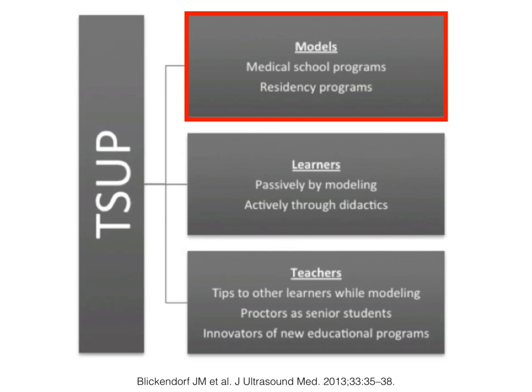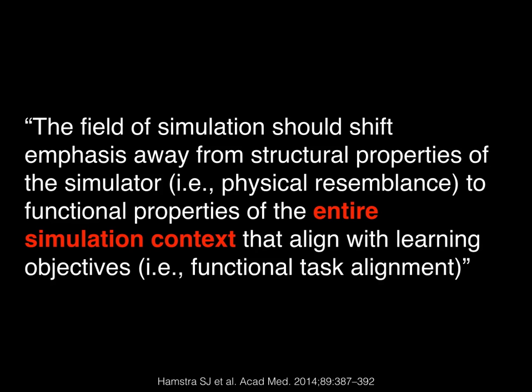But you can set up your simulation model to benefit you as you need. And you can see here the models and the learners and the teachers are all pulling things away from that. So in that education learning environment, this is a great model. And he brings it back that the field of simulation shouldn't necessarily focus on the resemblance of your simulator to people as a fidelity model, but rather the functional properties and how that simulator fits into your educational context. So you don't necessarily need the highest and most expensive simulator. You need what's going to accomplish the goals you need for that simulation task and for your context. And that depends on what you're trying to accomplish.